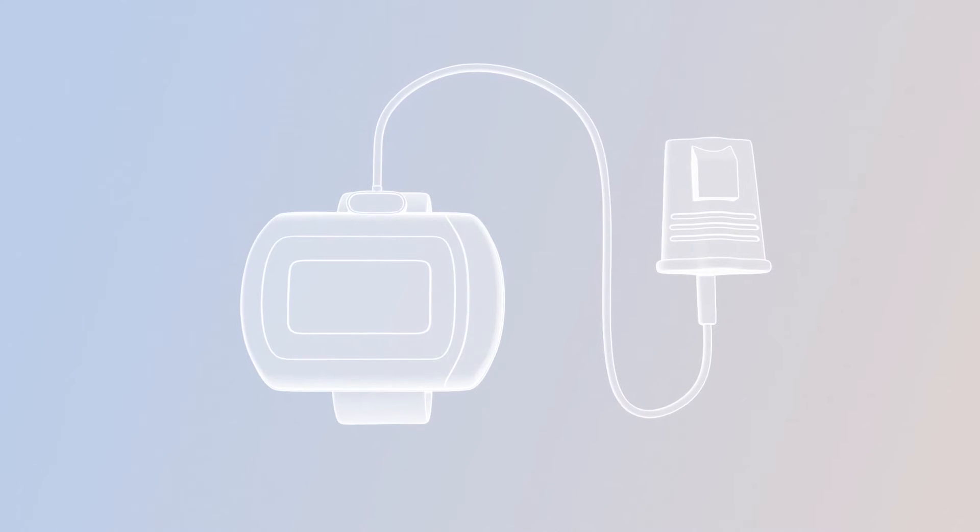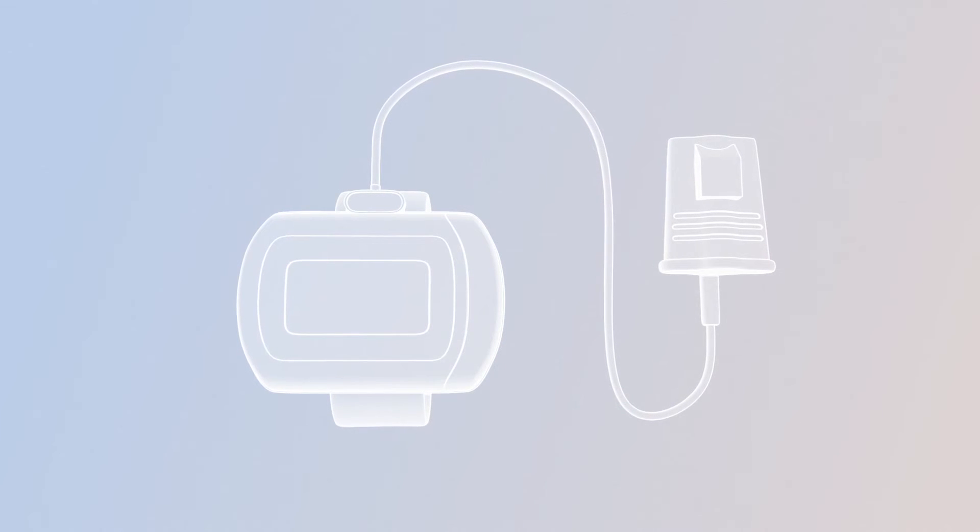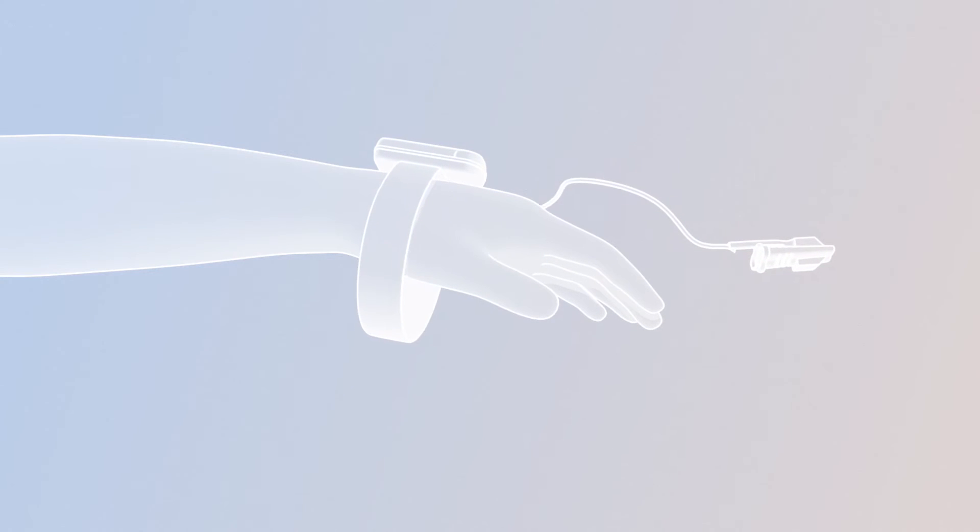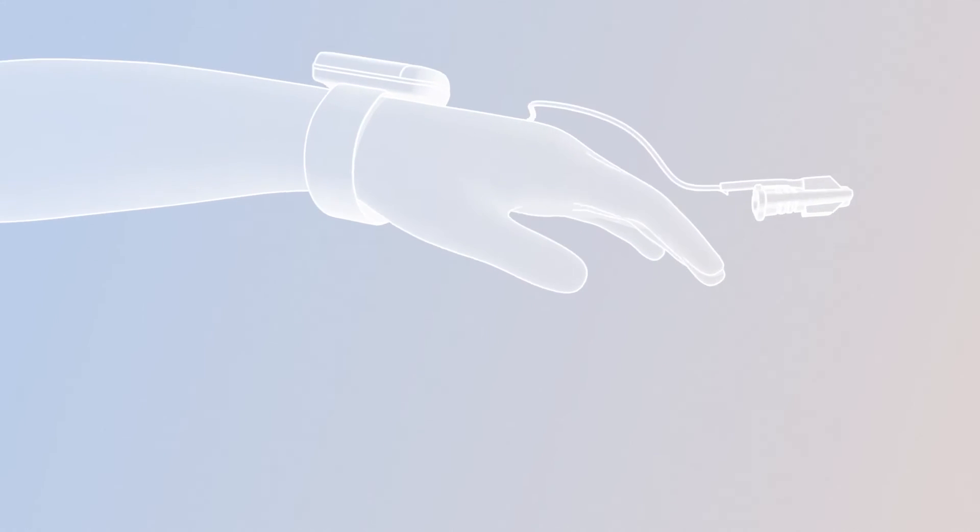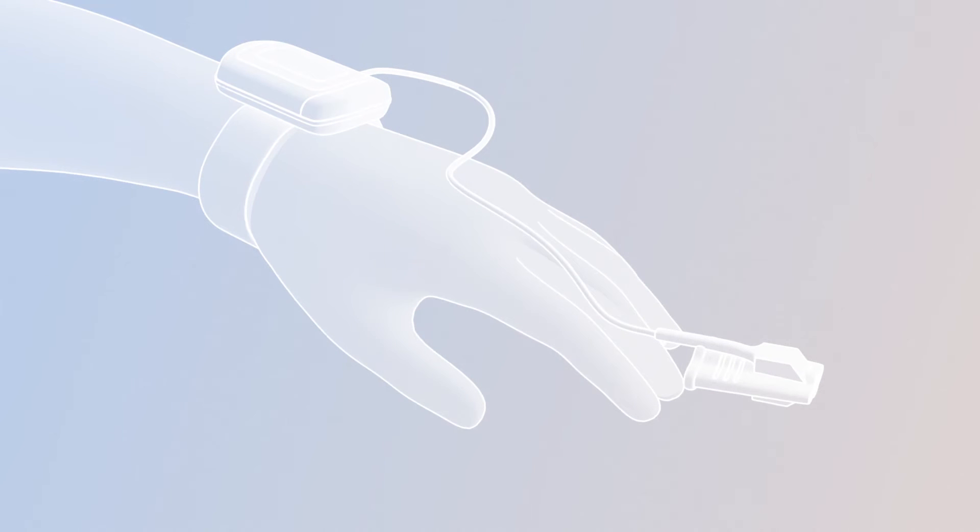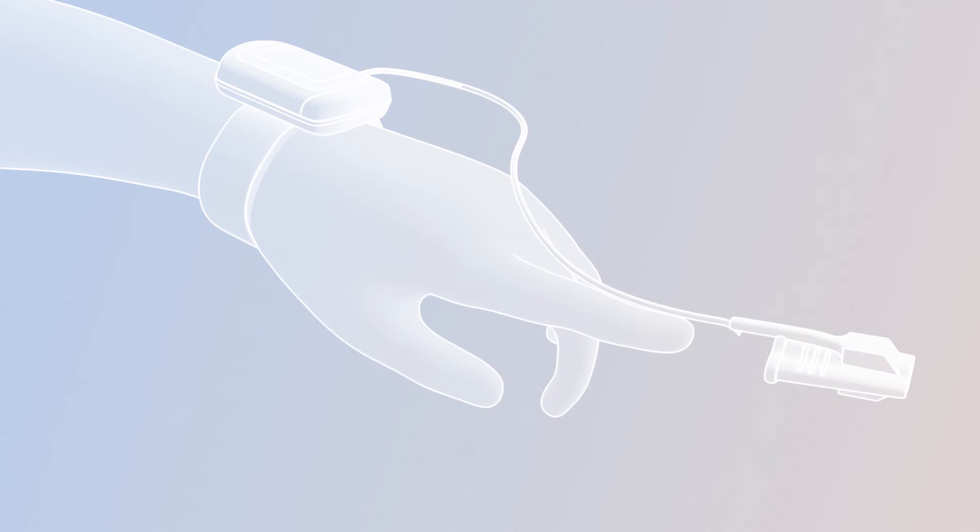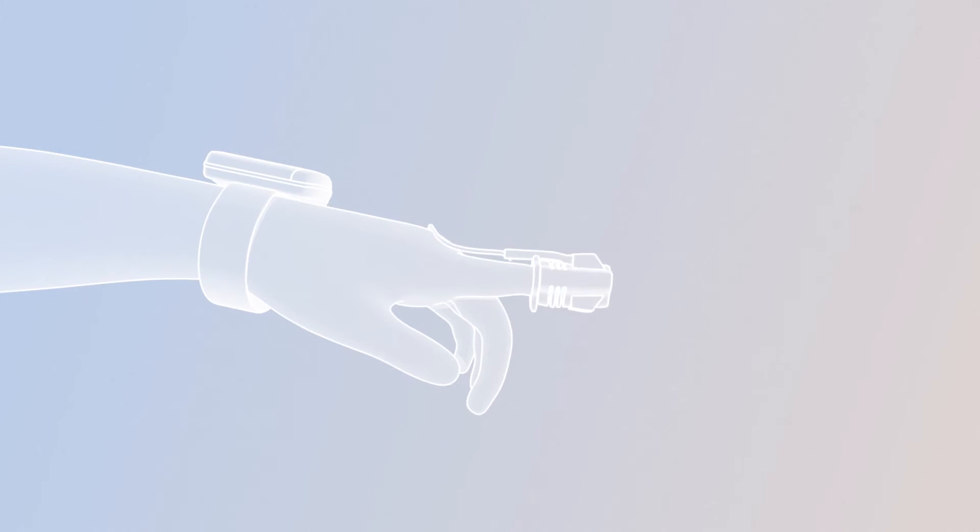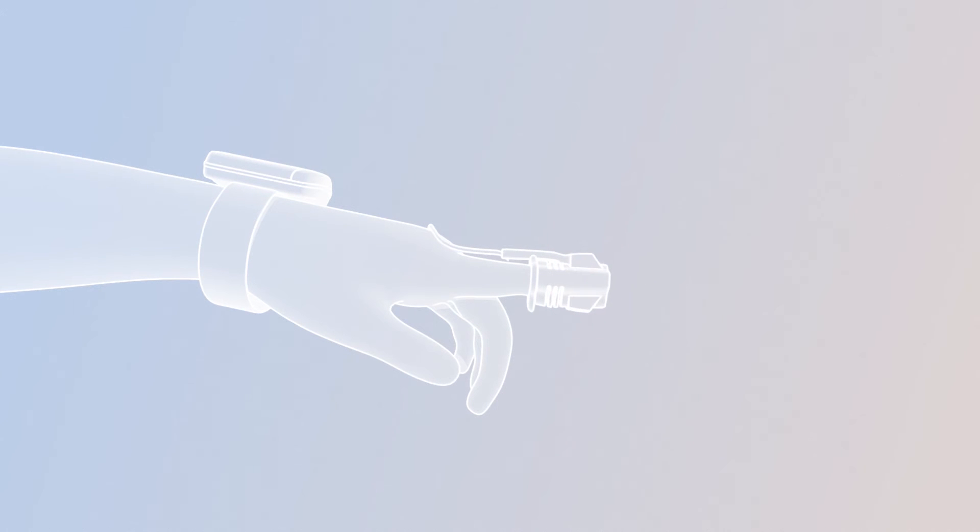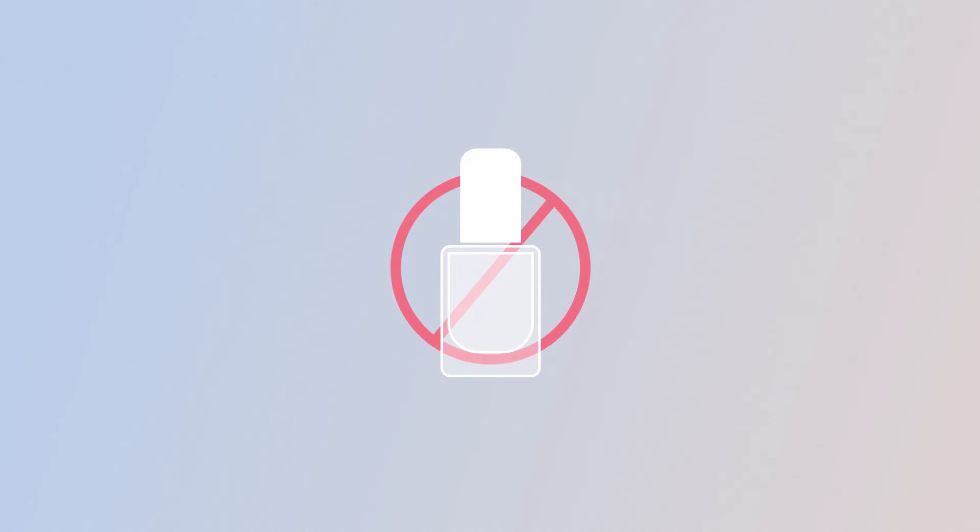The oximeter is placed on the wrist of either hand, like a wristwatch. Secure the velcro strap around the wrist. Place the oximeter finger probe on the index finger until the finger reaches the end of the probe. You can secure the probe with tape. To ensure an accurate reading on the pulse oximeter, remove any nail polish from your fingernail. It is okay to change fingers during the night.